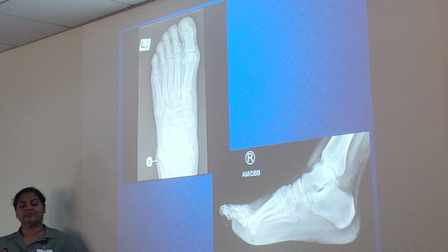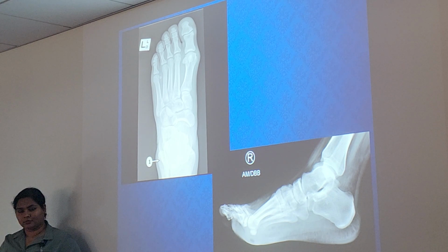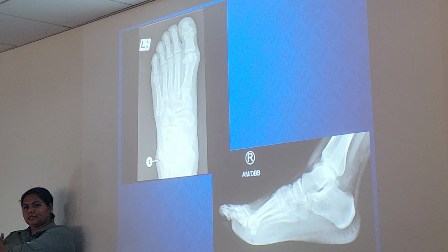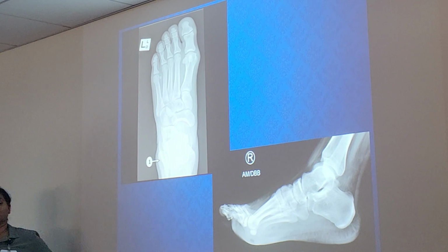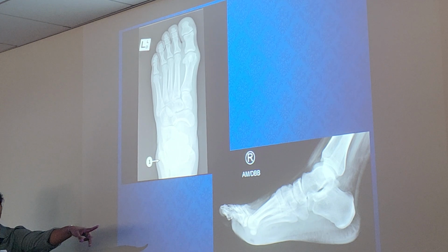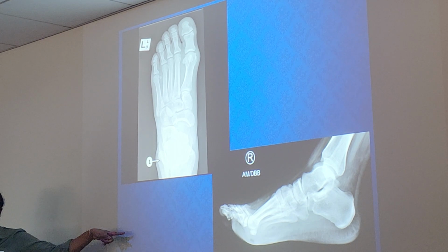Earlier we said, what's the difference between medial and lateral? Lateral is away from the body, right? Away from the center, and medial is closer towards the body. So when we're doing a right foot, the CR enters the medial portion and exits the lateral portion of that foot.